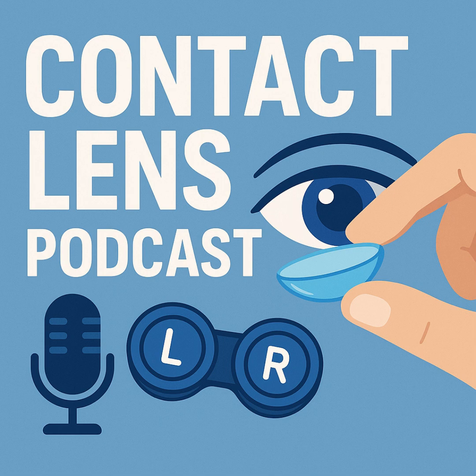And yeah, for most people, soft lenses are where it begins. Those lenses, right? They cover the vast majority. And they break down into a few main designs: spherical, toric, and multifocal. Okay, so spherical, that's the standard one for basic near or farsightedness. Exactly. If your eye is pretty much round up front, not much astigmatism, usually we say less than minus 0.75 diopters, a spherical lens works perfectly. It bends light evenly. Simple enough.